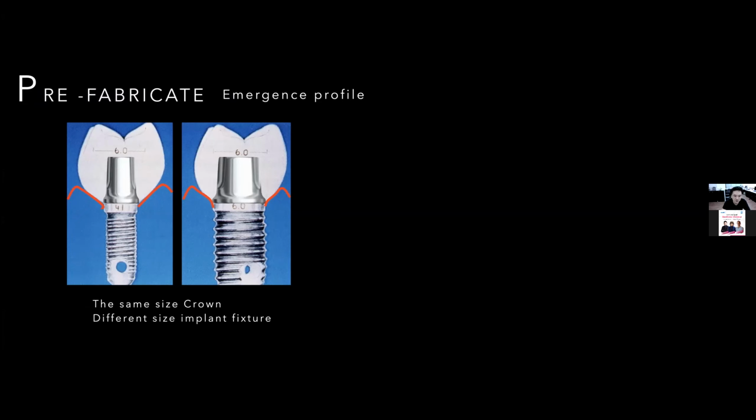So sometimes after the implant fixture, we need to think that the fixture size is never the same as the original root. So the emergence profile with the tissue is very important for dentists and for technicians. Because the dentist maybe wants to create a customized, beautiful tissue form, he needs to do modeling and impression to customize the tissue form for the technician, and the technician needs to duplicate it. So it is very difficult to make it the same.